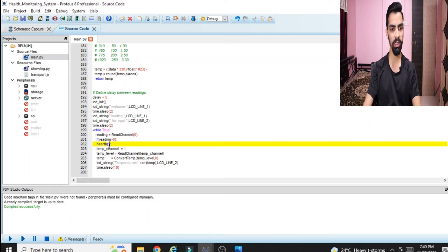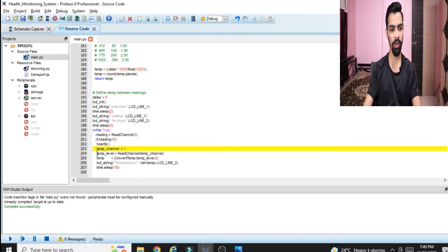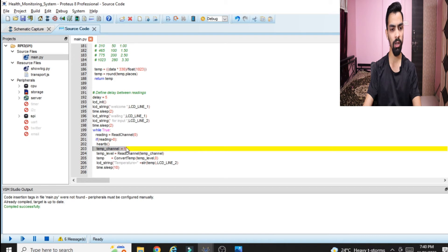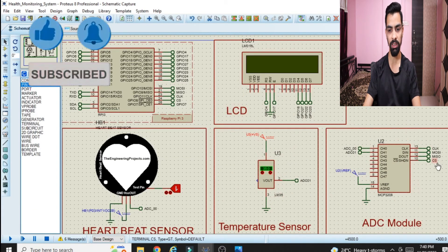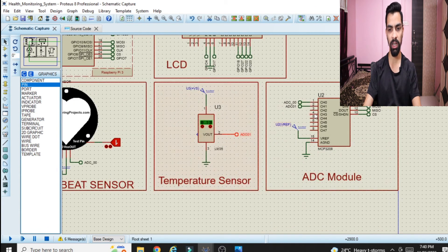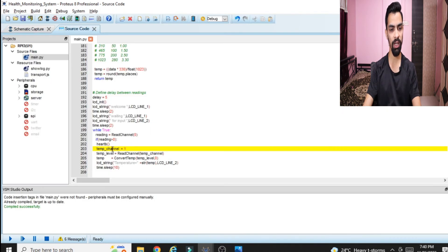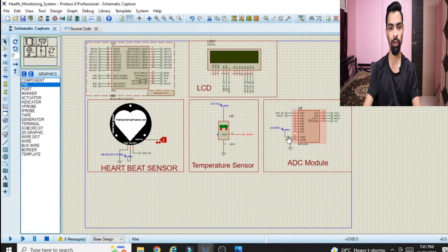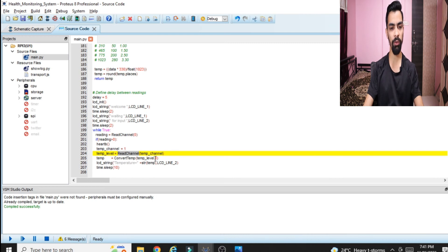In the first part we saw the program up to line 202. From line 203 onward I have added extra code to sense the temperature from the LM35 and print it on the LCD. At line 203, 'temp_channel = 1' because the temperature sensor output is connected to channel 1 of the ADC module. The function 'read_channel(temp_channel)' reads the analog value present on that channel and transfers it to the Raspberry Pi.